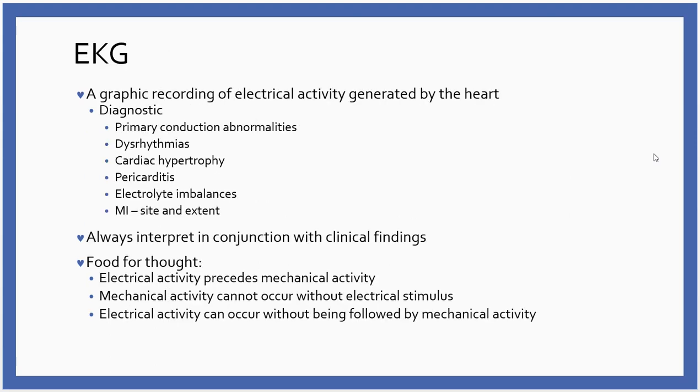Before we look at EKG, once again, make sure that you understand that EKG is just a graphic recording of electrical activity generated by the heart. You can have what looks like a beautiful sinus rhythm on the monitor and be dead. What do I mean by that? It's just electricity. That doesn't mean it's actually capturing and causing any changes to the myocardium. And so, we like EKGs. They're a good piece of diagnostic information, and it can tell us some things.